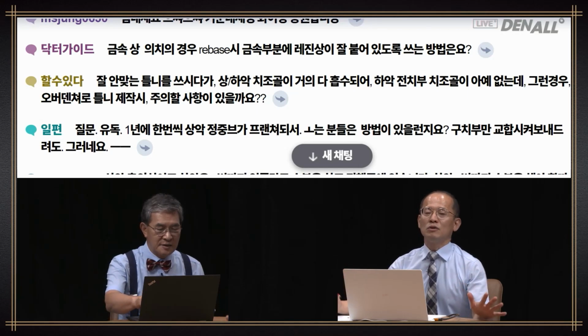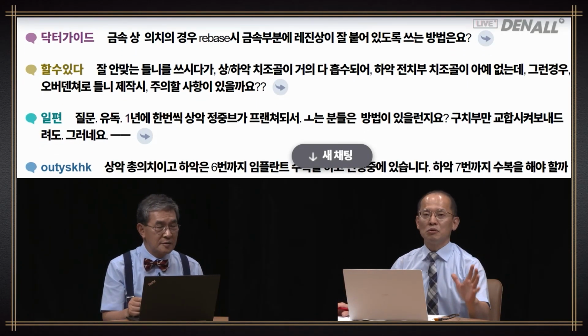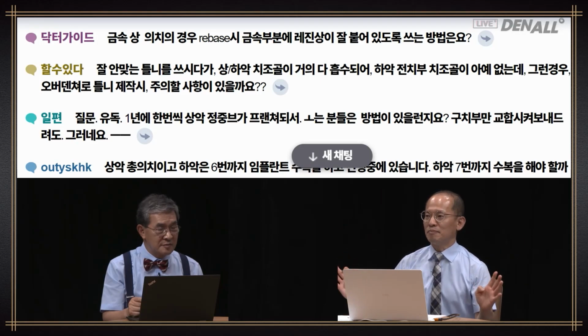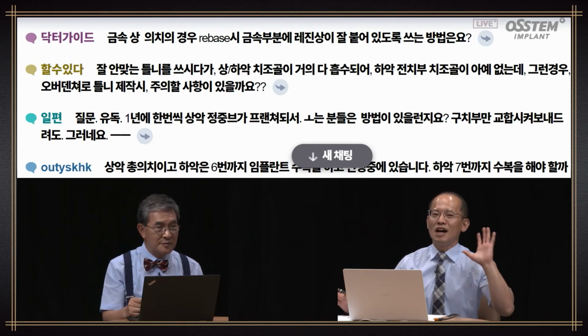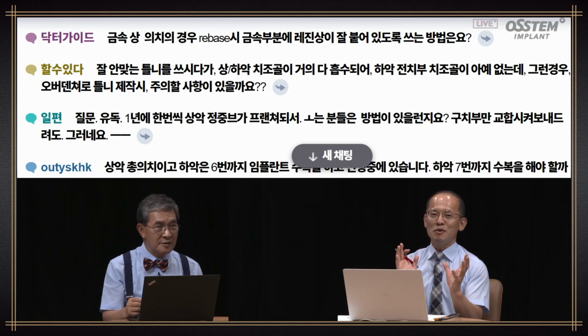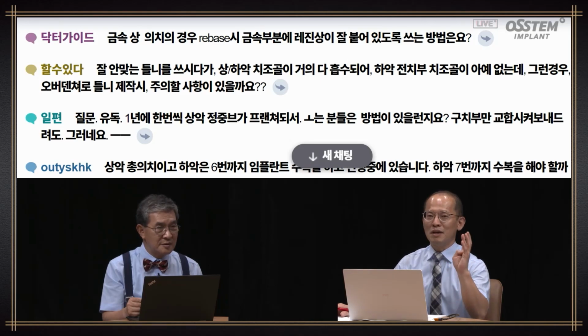It's part of one of my lectures, and I also talked about primer. But what you have to think about is that resin and metal do not attach in relining, so you create a large rough surface through sandblasting. Then the metal becomes black, but there's no chemical bonding, so a metal primer needs to be used.